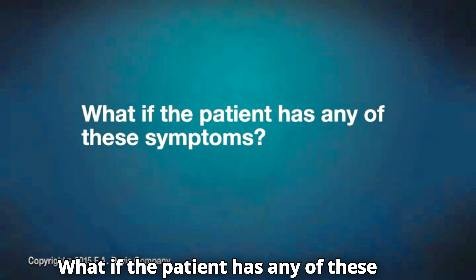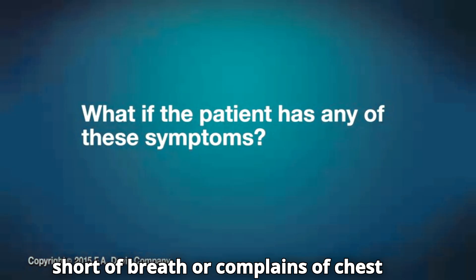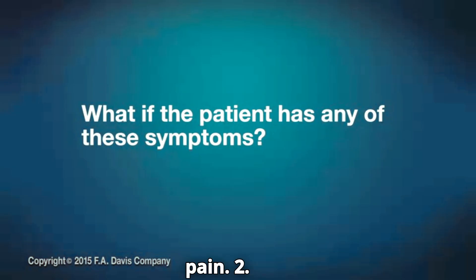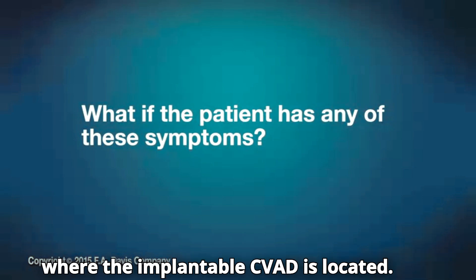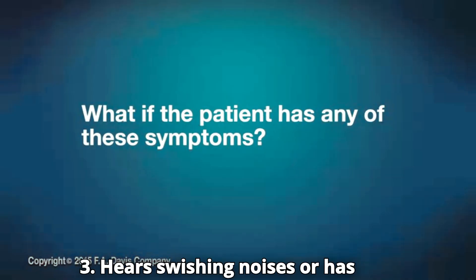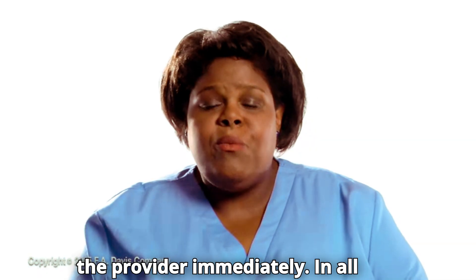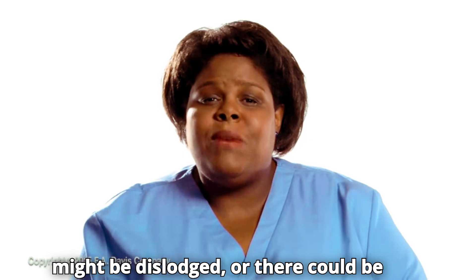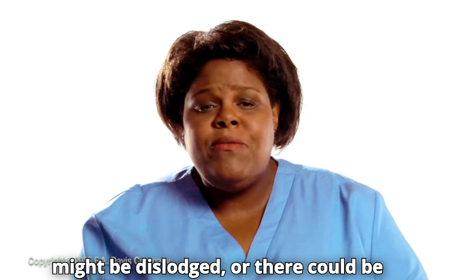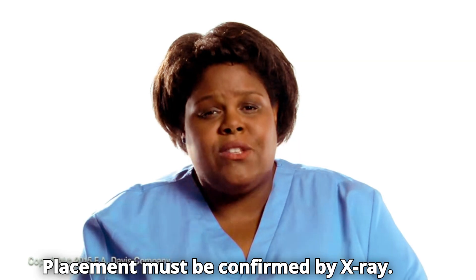What if the patient has any of these symptoms? One, is short of breath or complains of chest pain. Two, feels pain in the neck or ear on the side where the implantable CVAD is located. Three, hears swishing noises or has palpitations. Notify the provider immediately. In all these instances, the implanted device might be dislodged or there could be fluid overload or other complication such as a dislodged clot or embolism. Placement must be confirmed by x-ray.